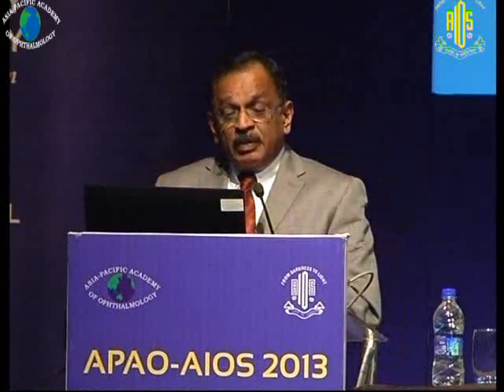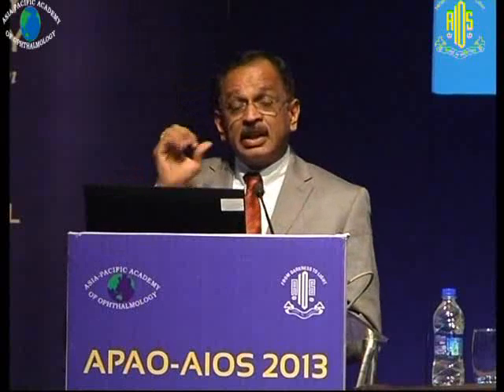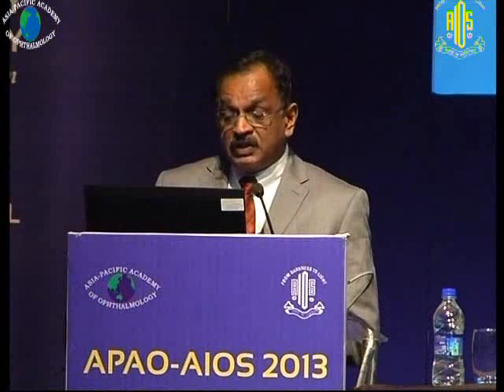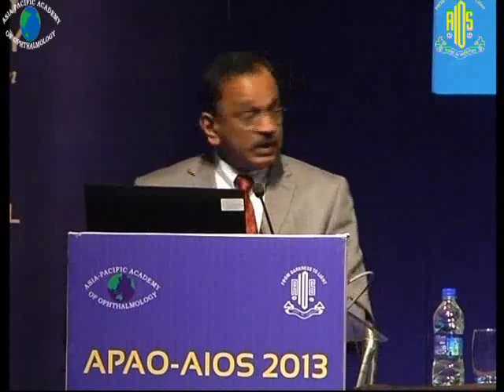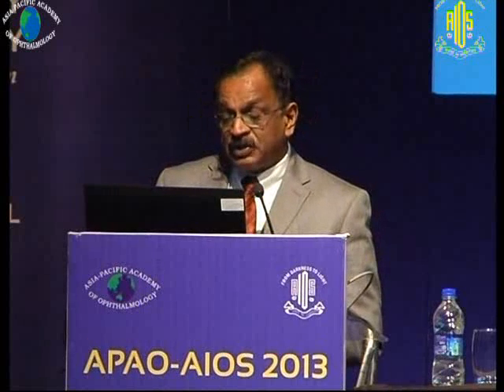In case of subretinal bands, you do remove those bands only if you are sure that this band is causing traction and keeping the retina from flattening. Otherwise, you don't need to remove all the subretinal bands. But if you have to remove them, you can make a small retinotomy and you could easily remove them through the retinotomies, as you can see in this video, where the subretinal band which is causing traction has to be relieved to flatten the retina.